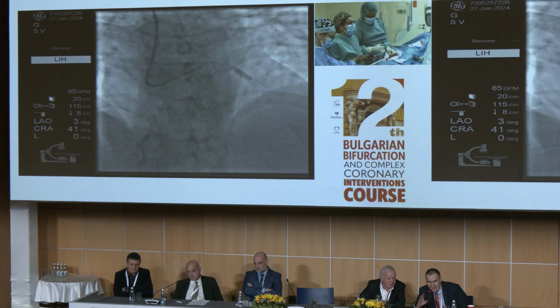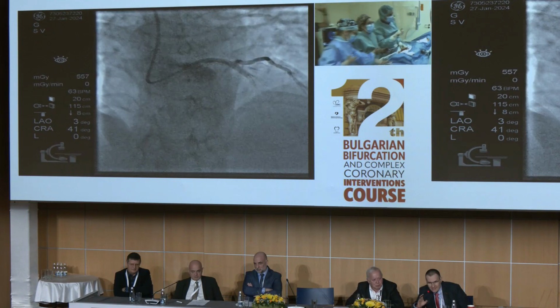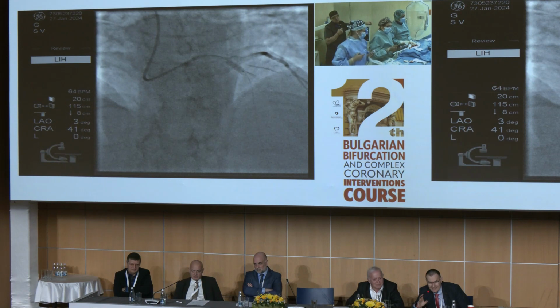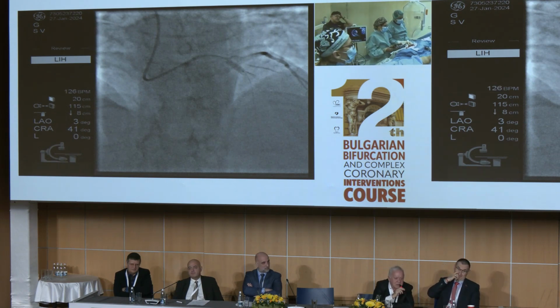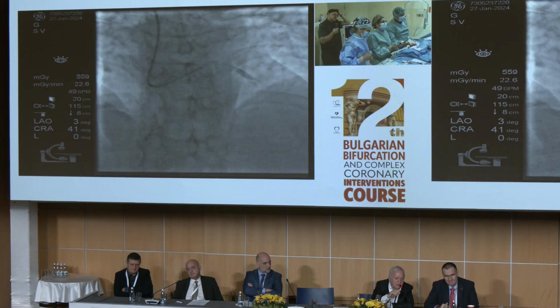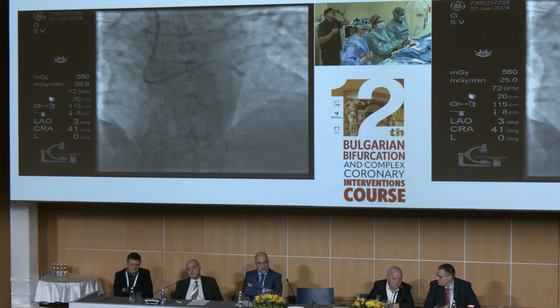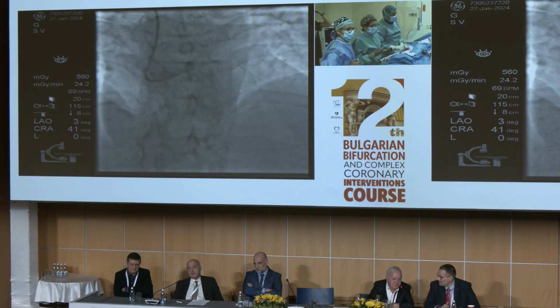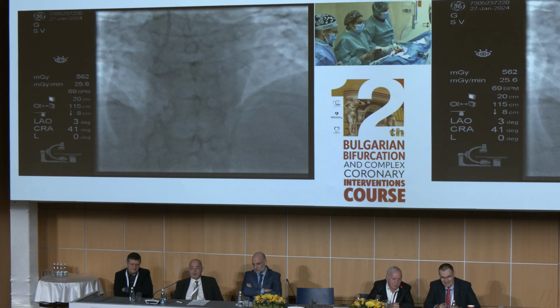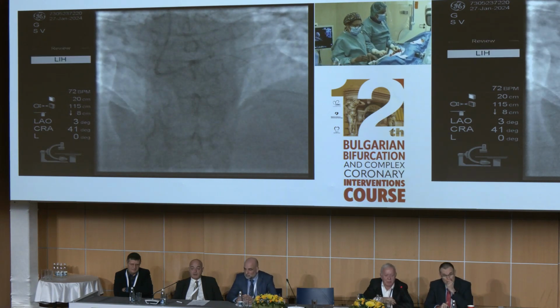We already did this. What did you finally take? This is 14, a semi-compliant ordinary balloon. Okay, we achieved 4.3 with 12. Is it the first inflation? No, this is the third one. Let's deflate. The third one, I guess. We increased from 9 to 11 to 14. Yeah.